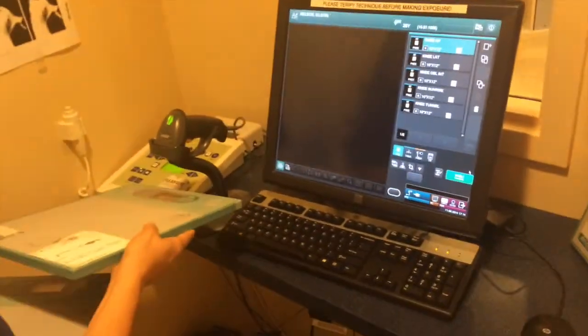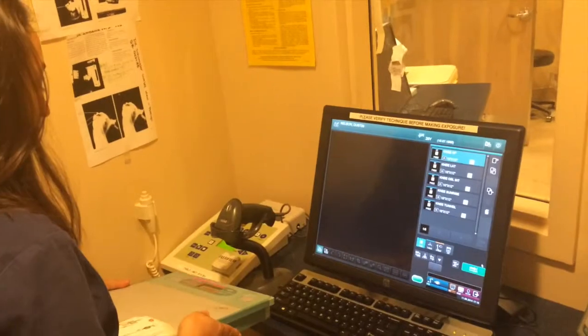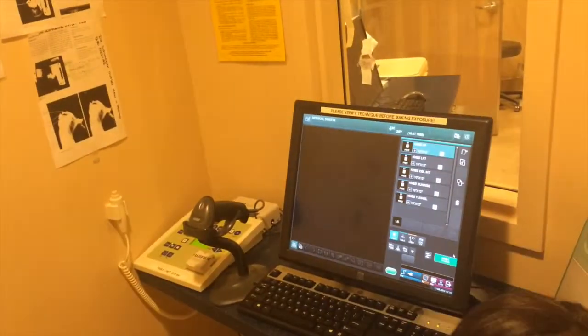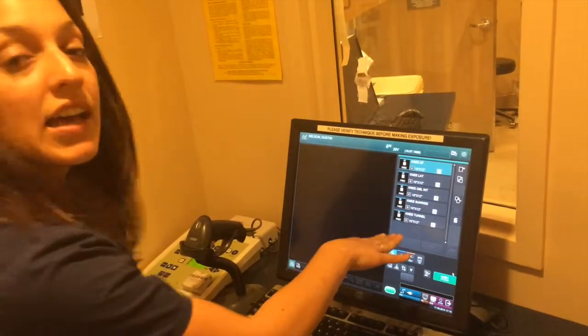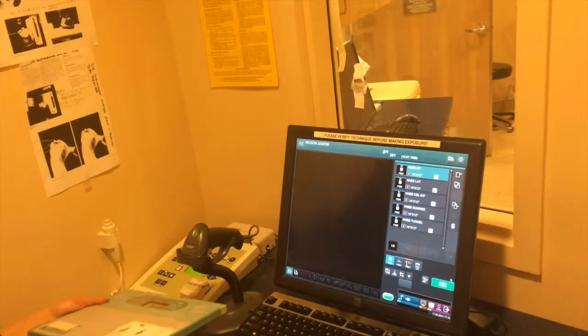Here is the AP, here is the lateral, and here's the knee oblique internal. Now the sunrise is also known as the Settegast that we did, and the tunnel is the Beclere. So here is the sunrise, and here's the tunnel. Now we're going to go ahead and run these images in the reader.